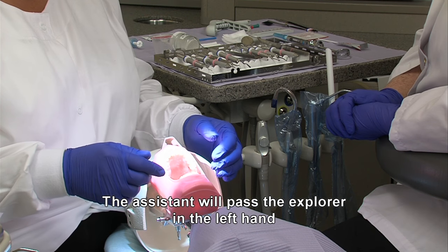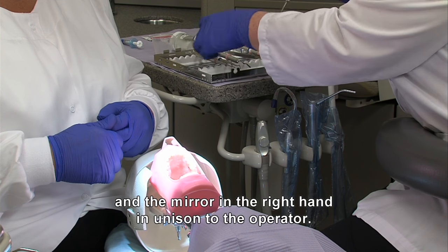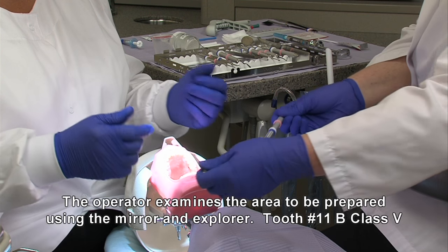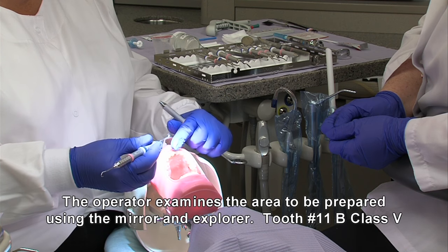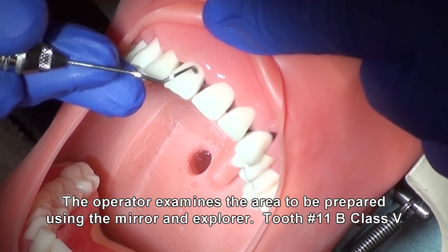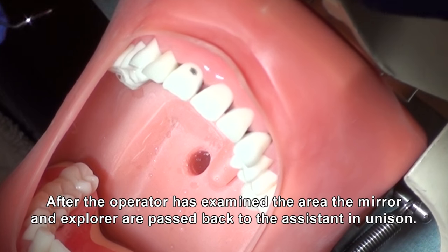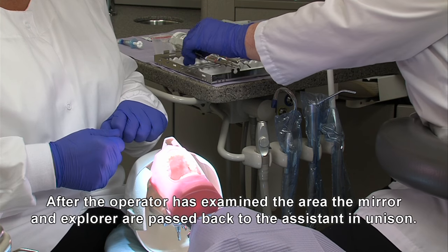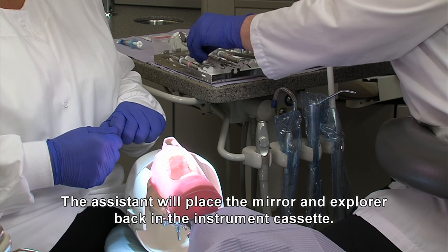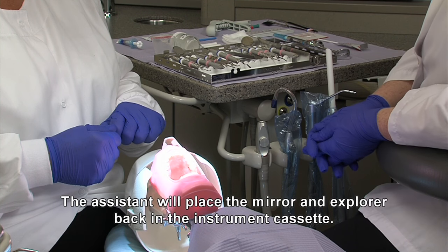The assistant will pass the explorer in the left hand and the mirror in the right hand in unison to the operator. Operator examines the area to be prepared using the mirror and explorer. Tooth number 11 buccal, Class 5. After the operator has examined the area, the mirror and the explorer are passed back to the assistant in unison. The assistant will place the mirror and explorer back in the instrument cassette.